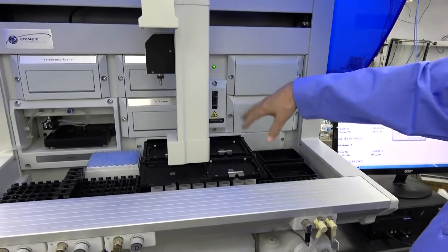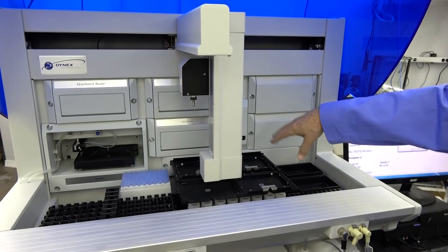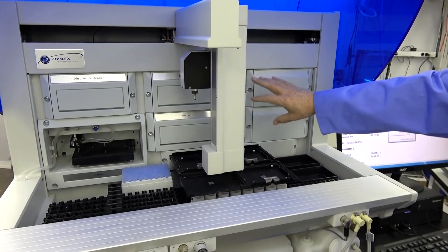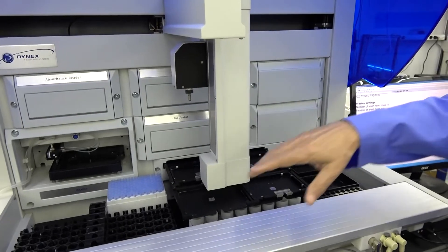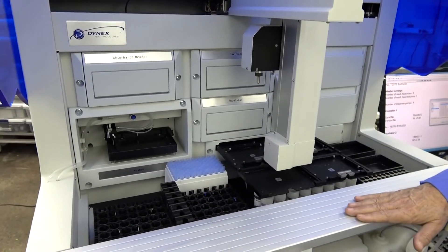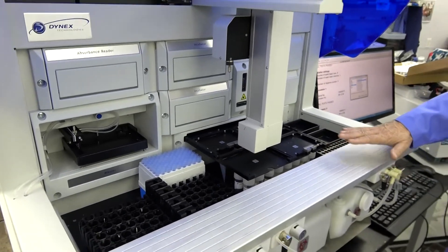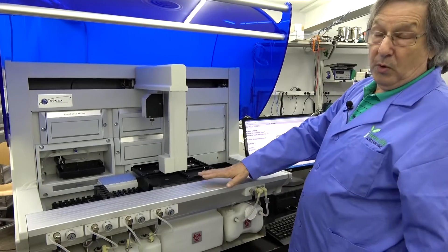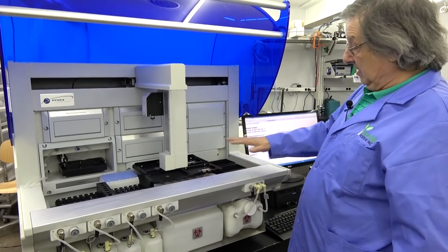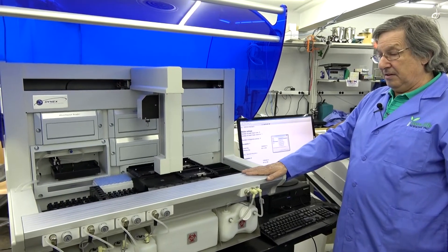We can do the same thing with the scanner. If you're going to be scanning your plates, these have dual scan — both a plate scan and a horizontal scan for scanning your sample vials. So those are some things you're going to want to be sure to check for when you get your new system — and that's the DSX-4 in this case. Thank you very much.